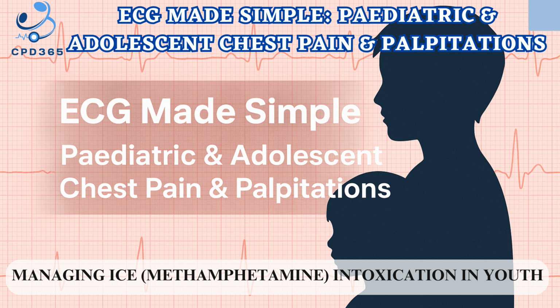Welcome to this CPD course, ECG Made Simple, Pediatric and Adolescent Chest Pain and Palpitations. This course is designed to help clinicians confidently interpret ECGs in young people, with a focus on chest pain and palpitations, two of the most common but often confusing presentations in pediatric and adolescent care. Over the next 2 hours, we'll work through practical cases, structured workflows, and red flag recognition to support safe decision-making.